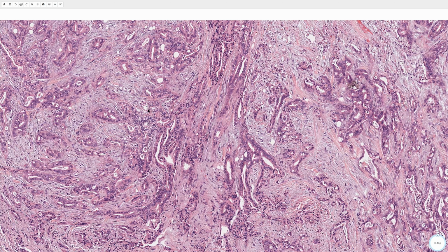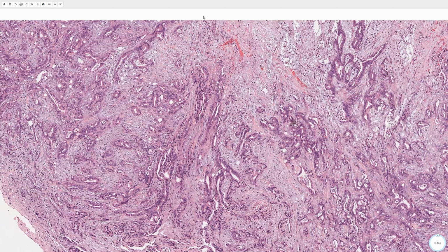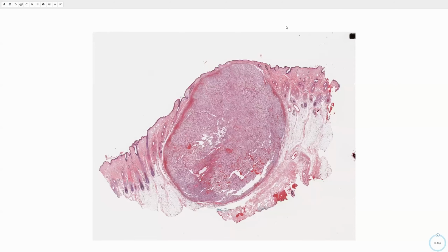So in contrast to colon cancer, which is CK20 positive, pancreas is usually CK7 positive, and will also label with cytokeratin 19 and CA 19-9. So that's something that you follow in the blood as well. And immunostaining is positive here as well.